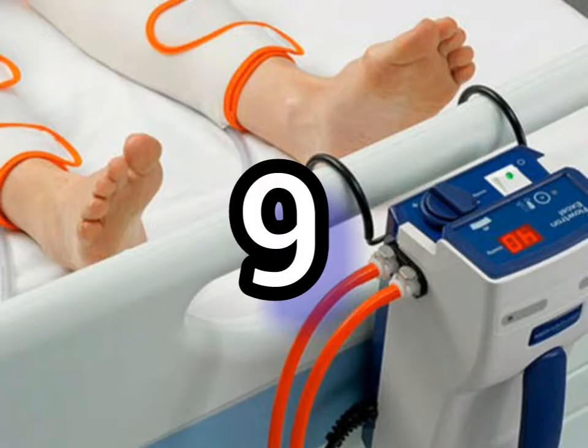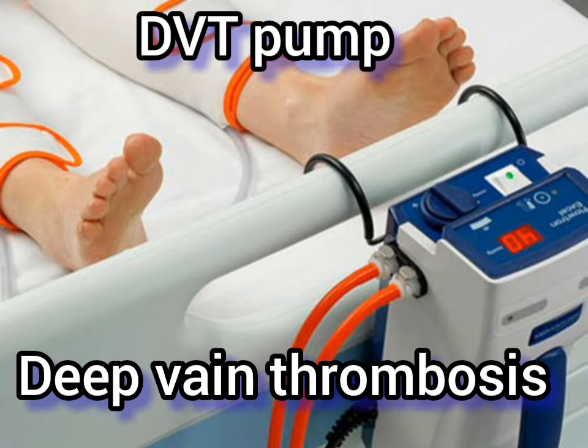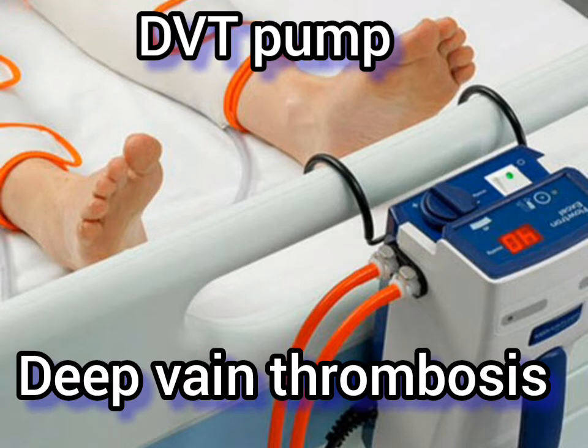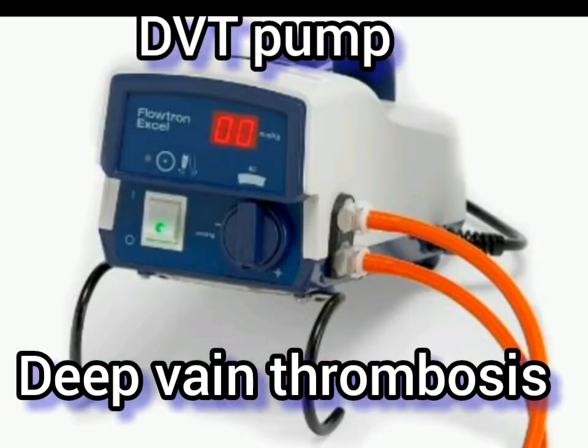Number nine: the DVT pump, also known as the deep vein thrombosis pump. It is used to prevent deep vein thrombosis in ICU patients who are immobile for extended periods.